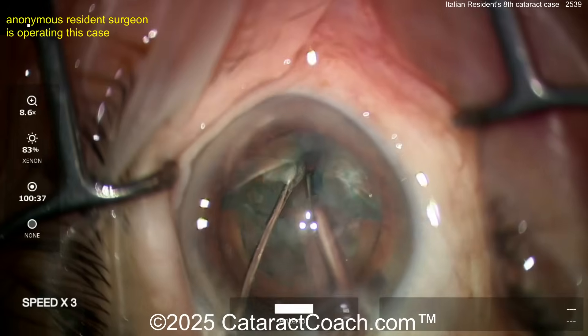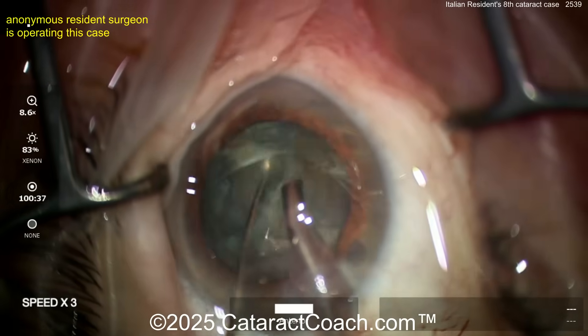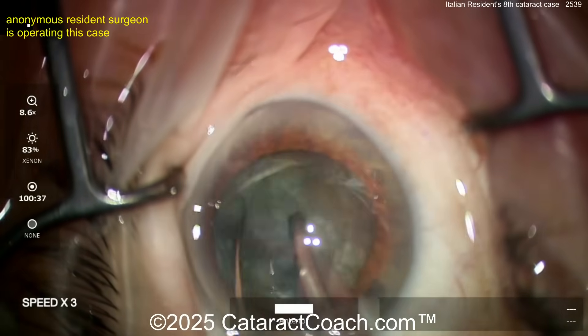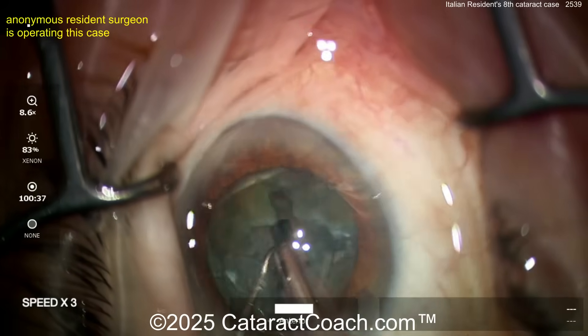If you're doing stop and chop at case eight, I'm blown away. Your goal is to learn as much as possible in residency — learn all the techniques, don't just learn one. Learn divide and conquer, learn stop and chop, learn every variation of chop you can, learn pre-chop, learn whatever you want. You want to learn more, not less. So this is a divide and conquer.